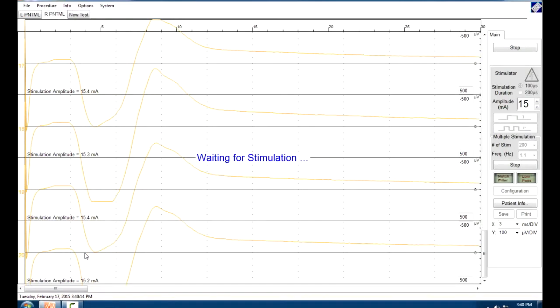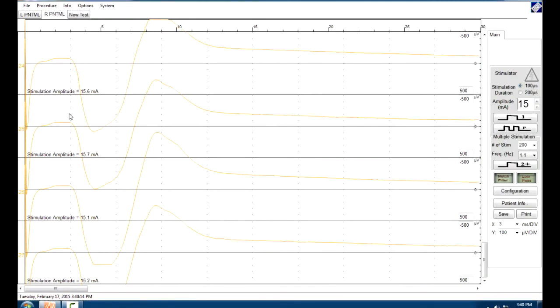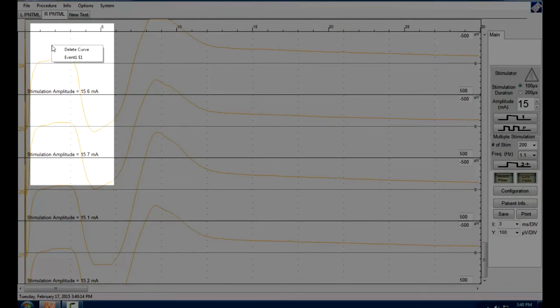You can see all these are looking pretty much the same. Along the left side here, you can see we've got our stimulation artifact. Then we get this plateau, and then it takes off. So we're going to take these top two just like we did before. Right click, event one, left click on the event marker, move it until it starts to deflect. So we're going to go right about there. We're going to go down to this next channel, event one, left click on the event marker and move it until it starts to go down again, right about there. And you can see again that these event markers are pretty much the same.